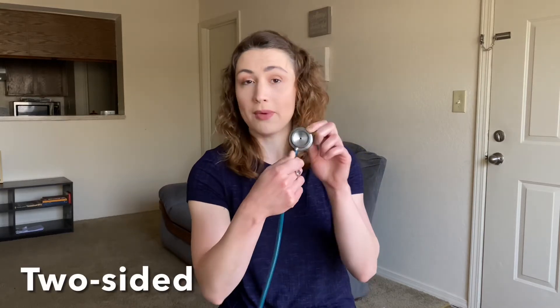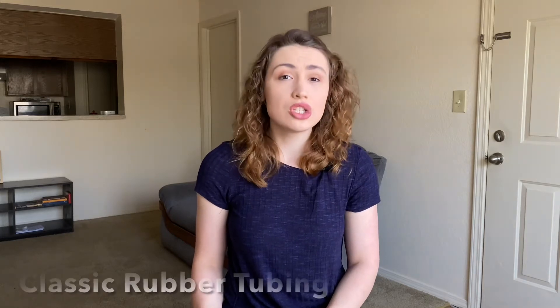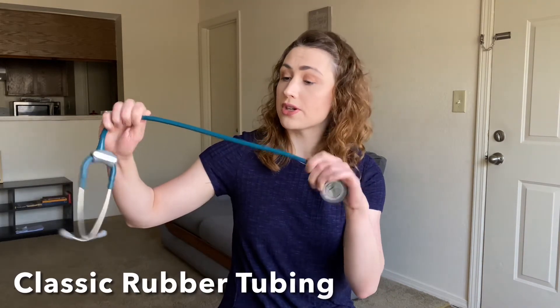The Littmann Classic III has a turnable diaphragm with two sides to listen to different pitches of sound. It's heavier than the Lightweight II stethoscope but not extremely heavy. The tubing is classic rubber tubing that's pretty lightweight. Personally, I had the Classic stethoscope throughout all of school because it was cheaper and I didn't have the money to drop on a fancy one.